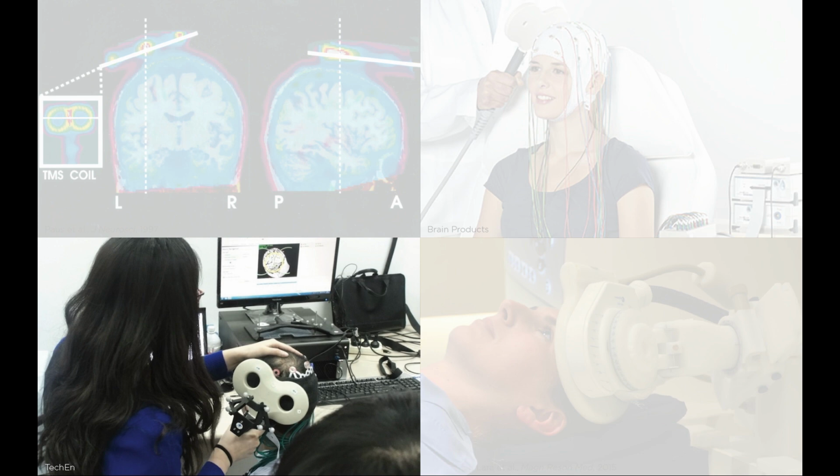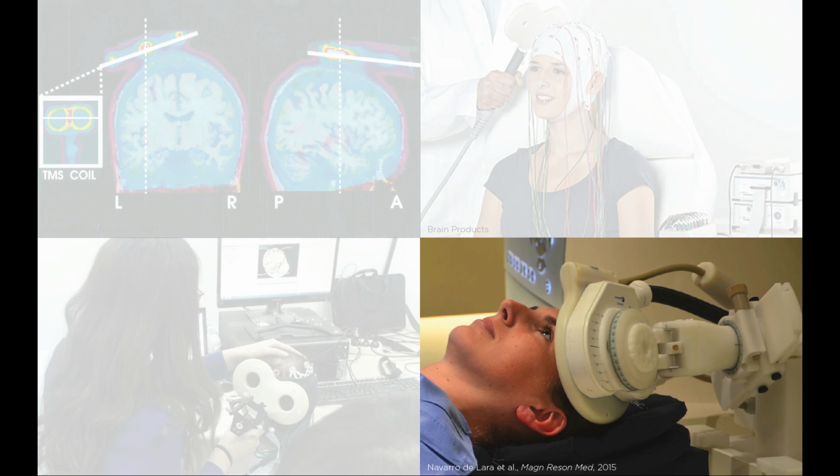The only thing to be careful of is that when you place these optodes on the head, it creates a natural spacer between the TMS coil and the surface of the scalp, so the induced electric field by the TMS would not be as strong as if the coil was placed directly next to the scalp. So one would have to account for the distance introduced by the optodes.